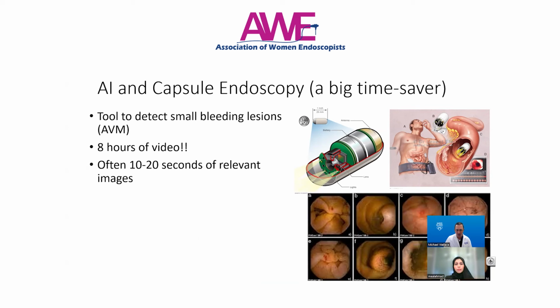We all are aware of how much video we get on these capsules, up to 8 hours of video, with often only 10 to 20 seconds of relevant information. But we have to watch those, and various hospitals allocate 60, 90, perhaps even 120 minutes of time for physicians to read these, much of which is not very useful time.